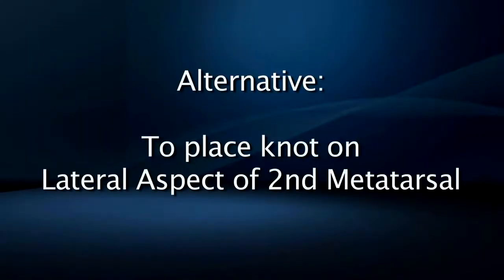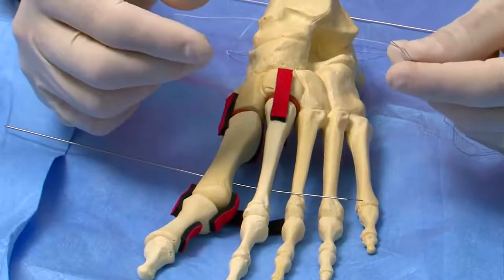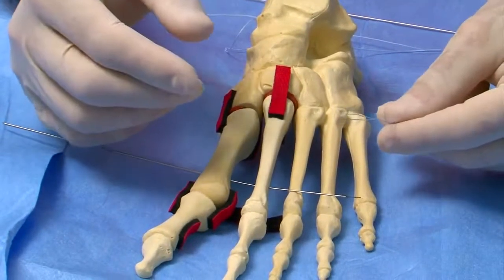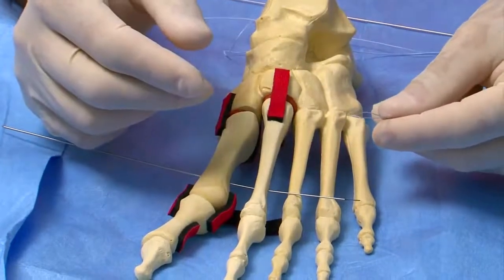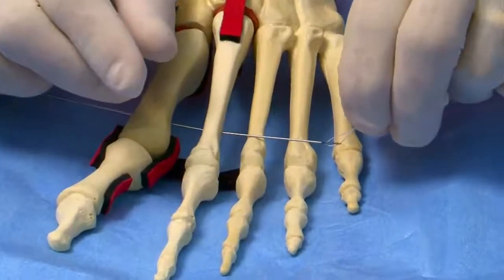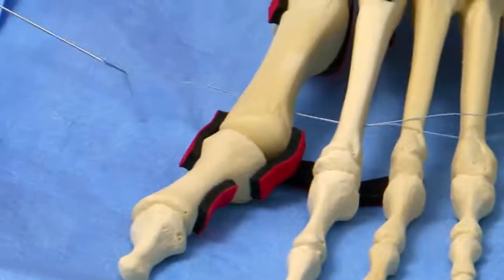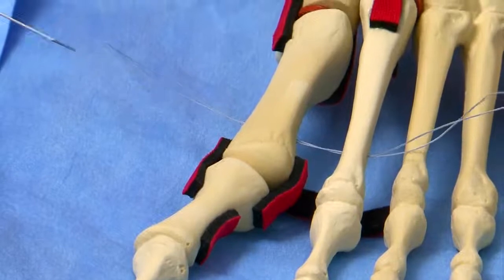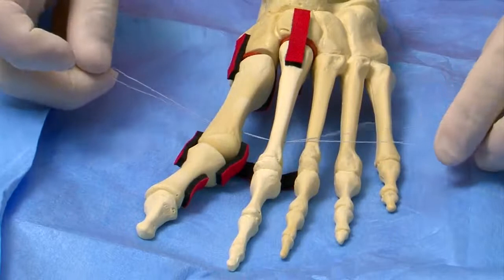Alternatively, if the surgeon prefers the knot of the mini TightRope on the lateral aspect of the second metatarsal, a 2.0 fiber wire can be placed through the nitinol loop and used as a suture passer for the mini TightRope in the following manner. The loop is passed through the first and second metatarsals, taking care to leave the tails on the lateral aspect to be able to pull the mini TightRope back through.